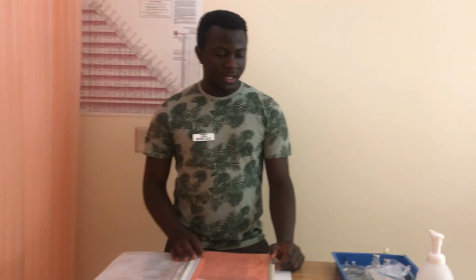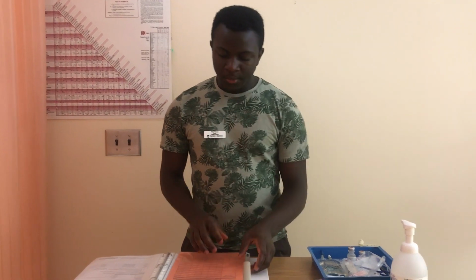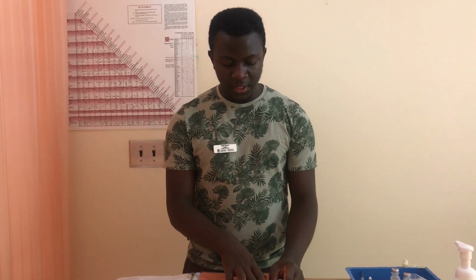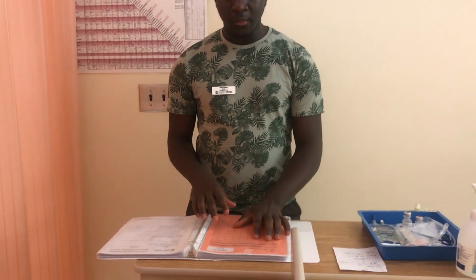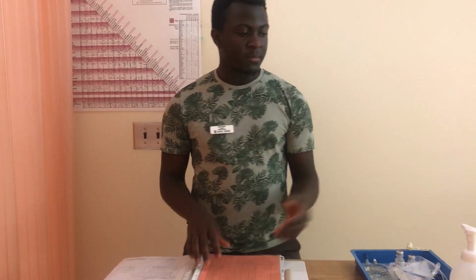I'm a student nurse and I will be showing you how to reconstitute and dilute a medication and then to administer it via a mini bag. Prior to this, I have compared my physician's order to the MAR, and I have seen that the physician ordered methylprednisolone, so I've compared that to the MAR to make sure that it is the right medication.